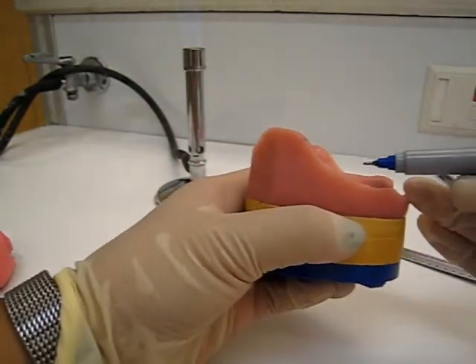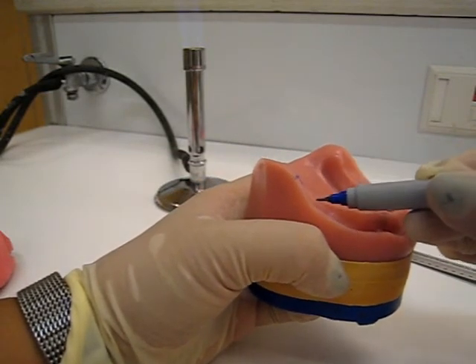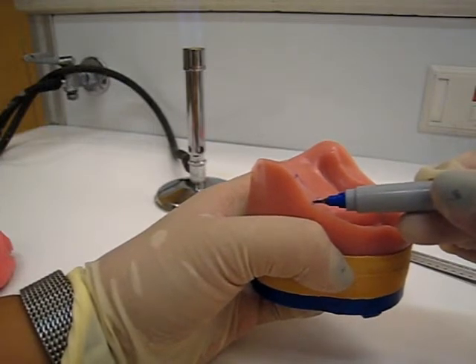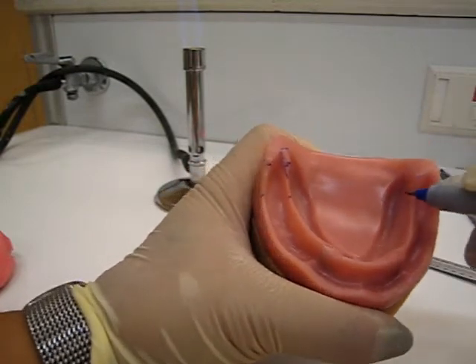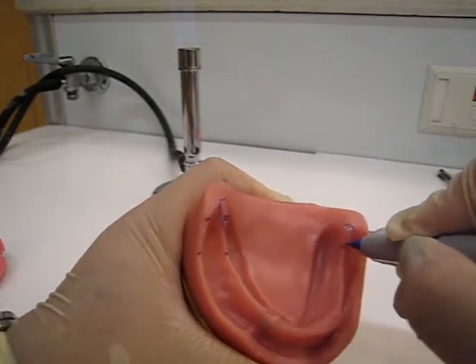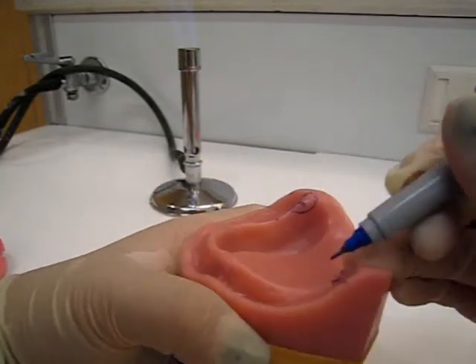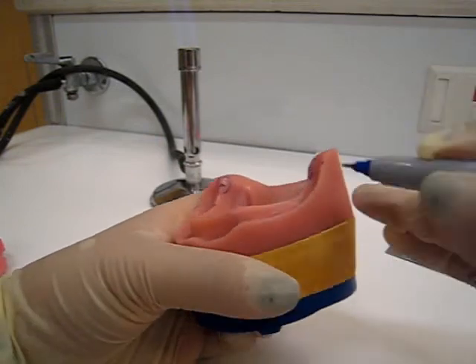The next thing you want to look at is where the ridge starts sloping up - it would be about here. And that is going to be the posterior extent of the occlusal rim. Let's go ahead and do the same on the other side: retromolar pad, half the height for the height of the occlusal rims, right when it starts sloping - the posterior extent.